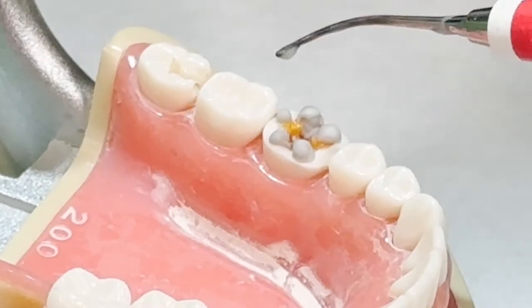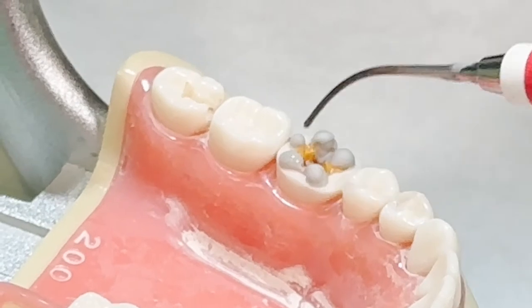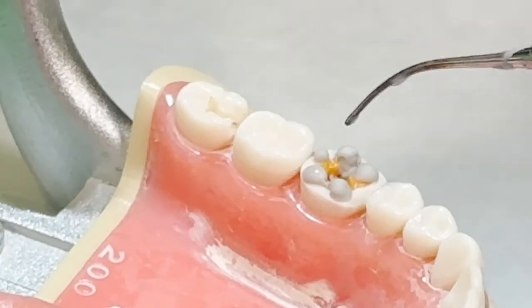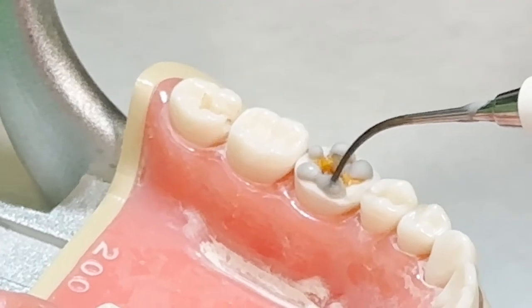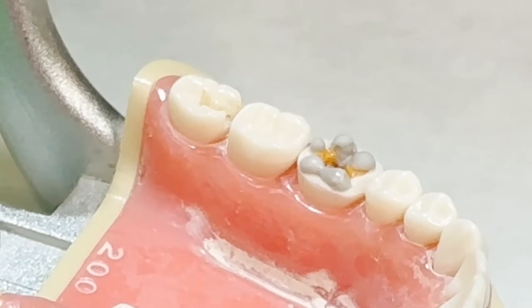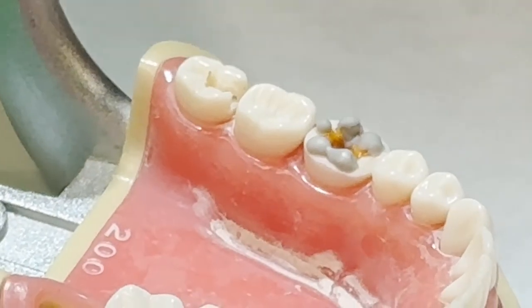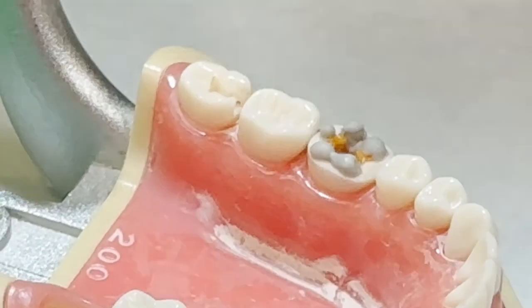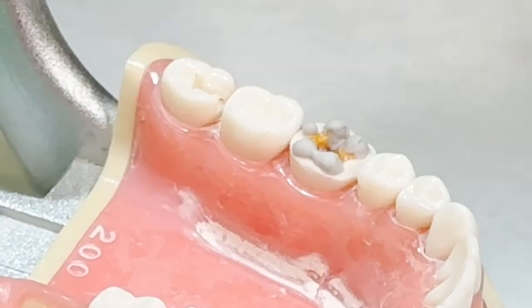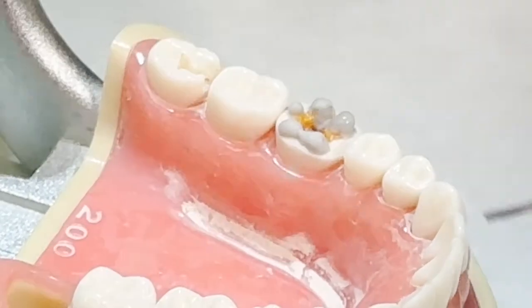Again, I'm not that good at this. If I was a lab tech, this would be done real quick, but I'm not, so. But you can get the idea, and it shouldn't take too long to get these kind of where you want them, okay? One of the main mistakes I see students doing is these are generally too close together, and the marginal ridges are too close to the occlusal table. They don't go out far enough. So we'll show you that as we go along.